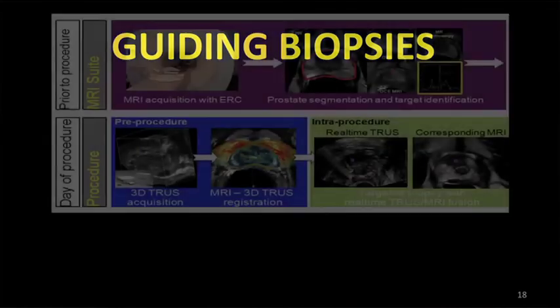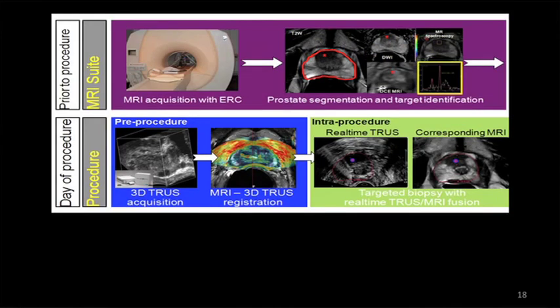So for diagnosis of prostate cancer, imaging is an important component, but findings need to be validated by biopsies. And now in the next few slides, I'm going to show you how we do these image-guided biopsies in NCI. We build up a system in NCI. We obtain the MRIs. We process the MRIs. We segment this prostate gland. We mark the lesions on these MR images. We export them into a platform which fuses the MR images, pre-obtained MR images, to the real-time transrectal ultrasound.